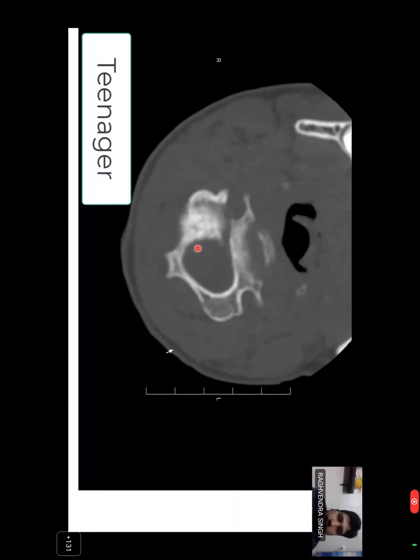There is an expansive growth on the posterior element of the spine, with a different level of mineralization. Perfect. Sclerotic, right? Heavily mineralized.